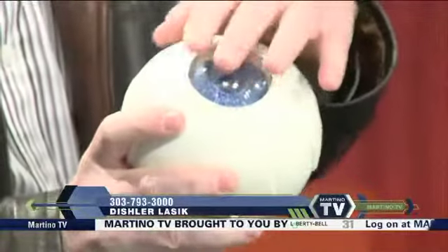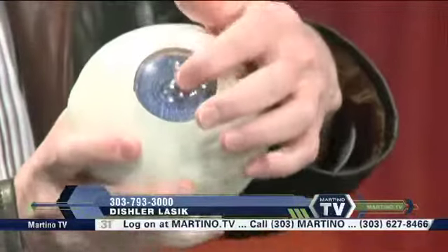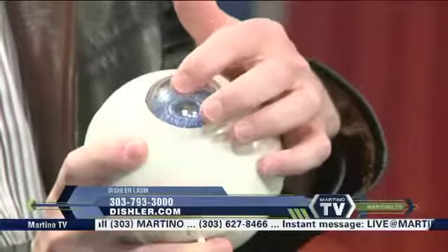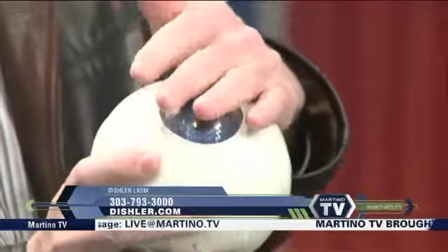Right. So what we're doing is we're making a flap, just like we do in all of our LASIK procedures, and then we're putting in this very, very tiny implant, much smaller than the pupil. So it's a tiny little circle, like the size of a very tiny piece of confetti or a seed. Then the flap goes back down, just like we were doing a LASIK.